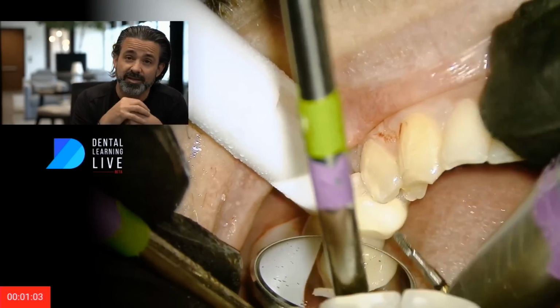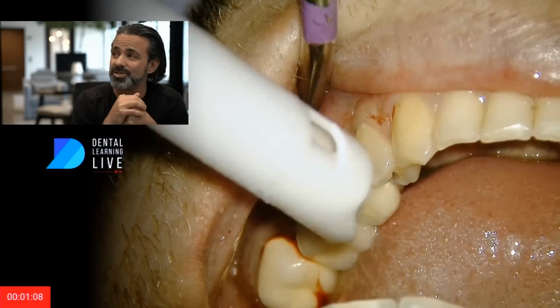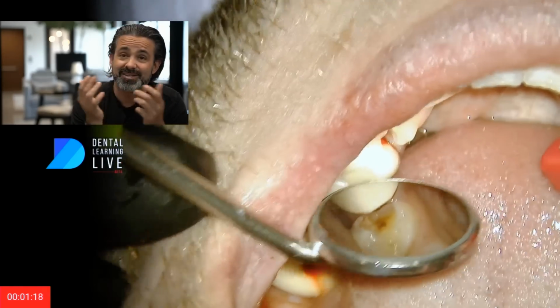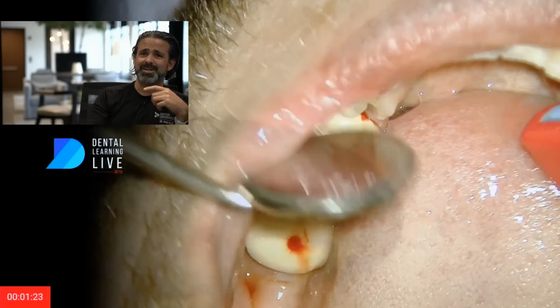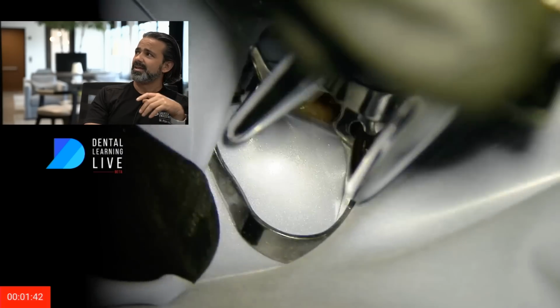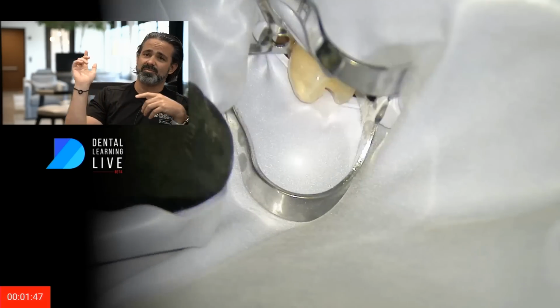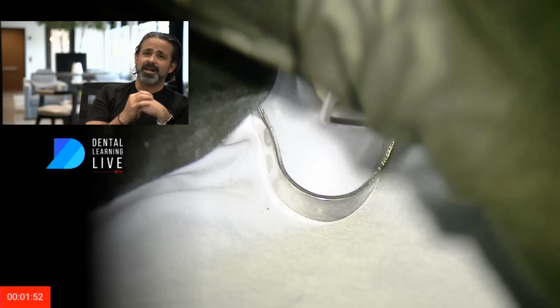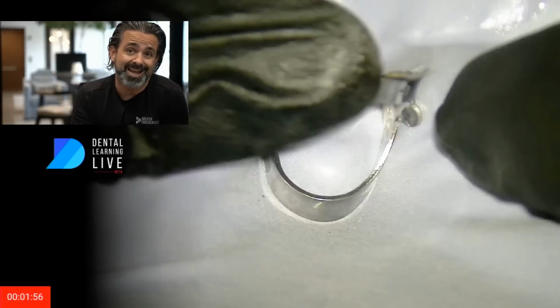If you look at the intraoral feed right now, there was a failed restoration, and we're just taking it out. I am doing it without the rubber dam on, frankly, because I don't want to tear my rubber dam when I'm starting. The patient's been anesthetized, and it is a vital case, symptomatic. You saw that I removed the decay, removed the filling, and then single rubber dam placement with wing clamps. I do that a lot. There's tons of ways to do rubber dam isolation, but for me, that's the way I like.